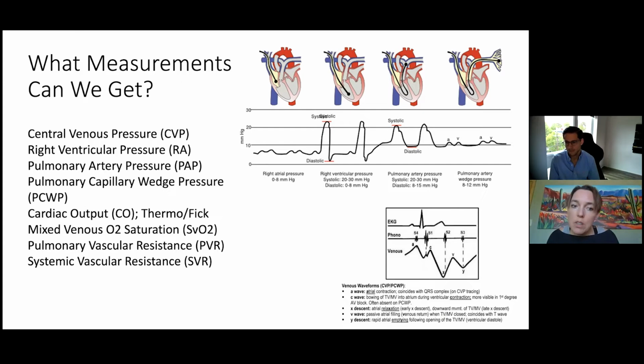I just wanted to introduce that to everybody because we did a nice job of talking about the tracings in the last presentation, and I think it would be helpful to do a very short primer on the Fick versus thermo. Yeah. Yep. Sincerely, it's harder to understand the thermo, but it does make sense, sincerely.